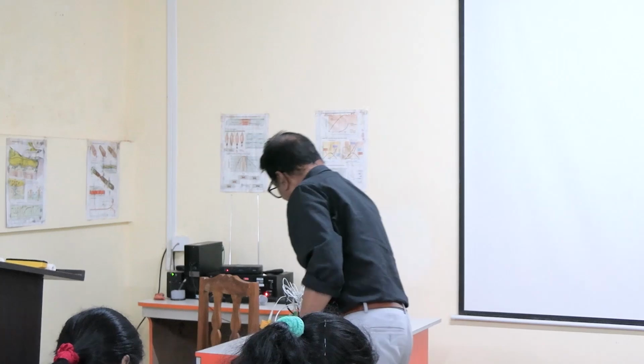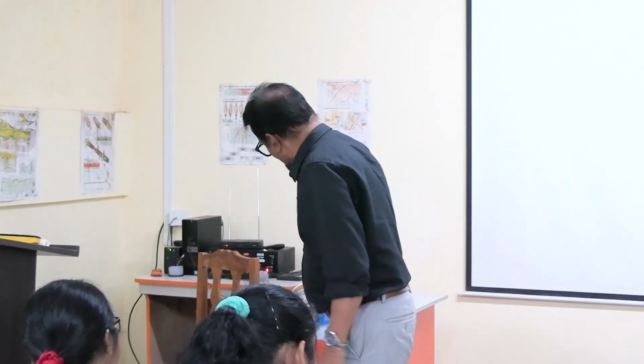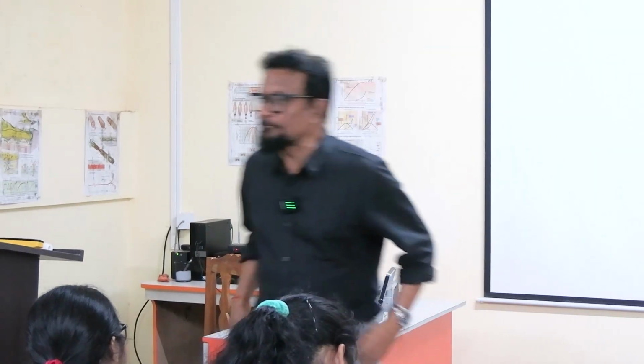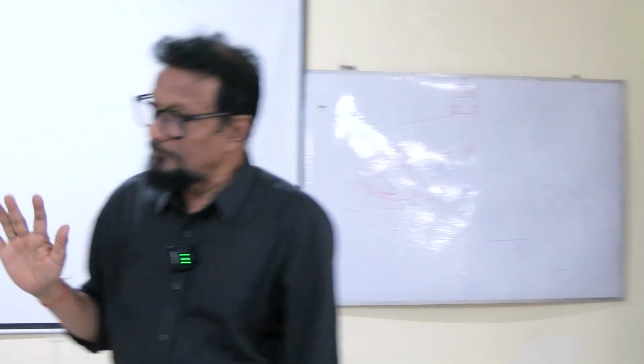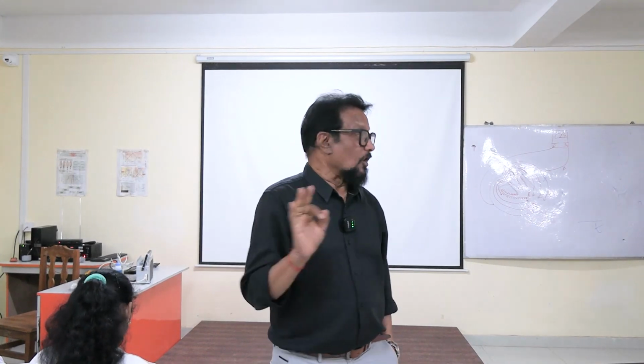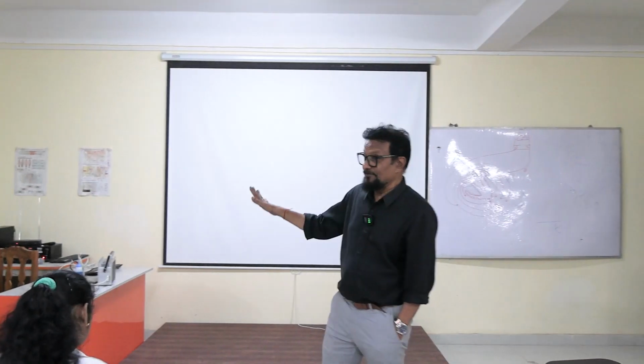We learned ECG is electrocardiography, a procedure, technique, method. Then what is this machine called? The method uses a machine. What is the name of this machine? Somebody says electrocardiogram. Is that okay? Wrong. It is electrocardiograph.